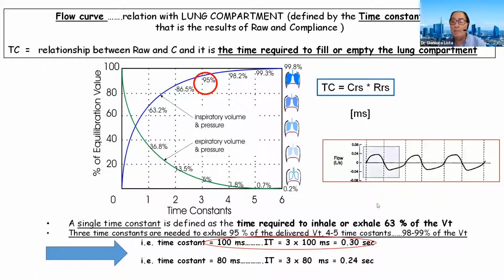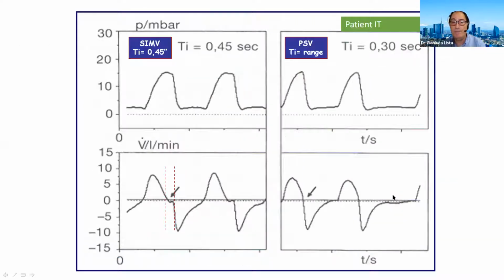But you are helped in understanding if the inspiratory time is right or not only by observing the flow curve. If the inspiratory flow goes towards the baseline and immediately starts the expiratory flow, this flow curve gives you the answer. Your inspiratory time is right for this baby.